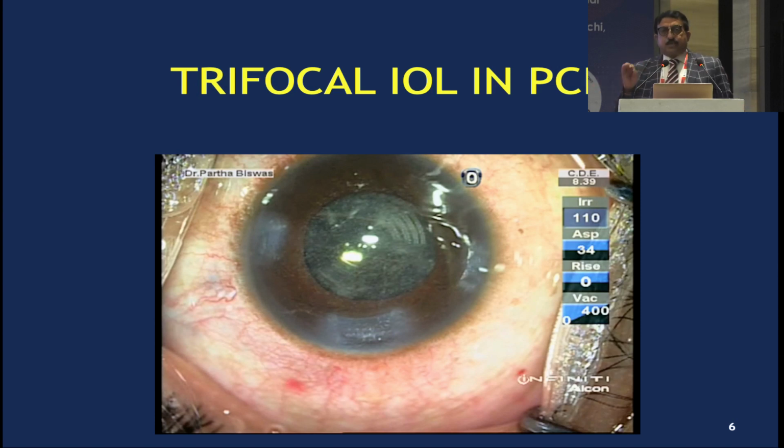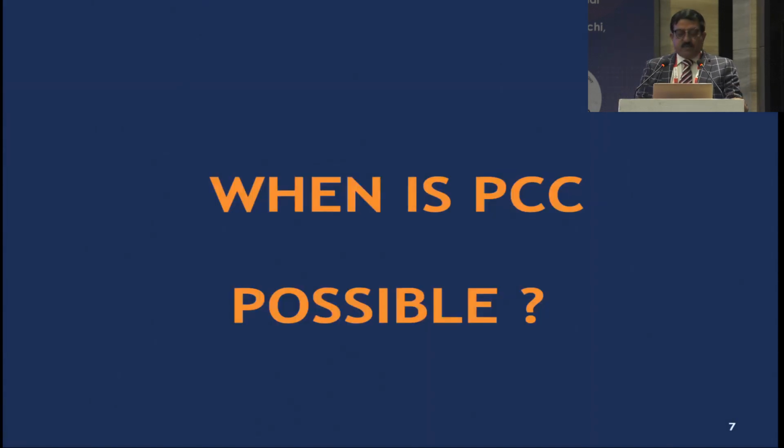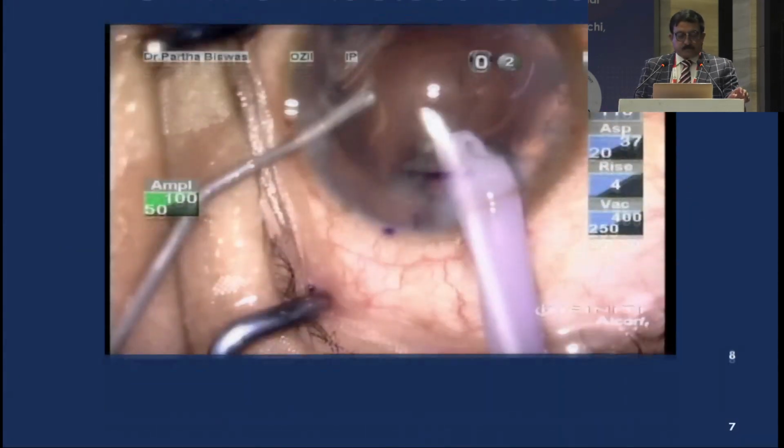So these are situations which are very, very judicious. If you have separated the torn posterior capsule from the anterior capsule, you have that space and you can place the leading haptic in. That's the first thing. If it has gone in, fine, go ahead with the trailing haptic. But if it has not gone in, please take out that lens and replace it with a three-piece lens.